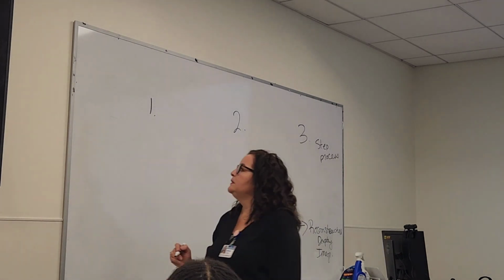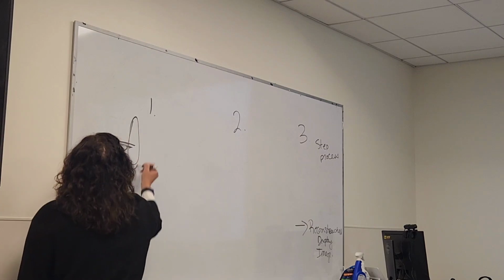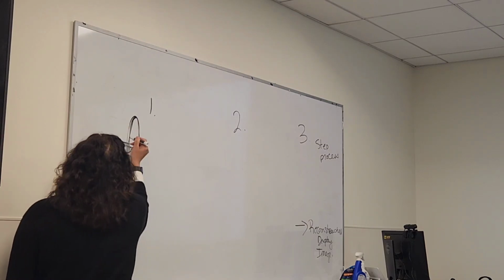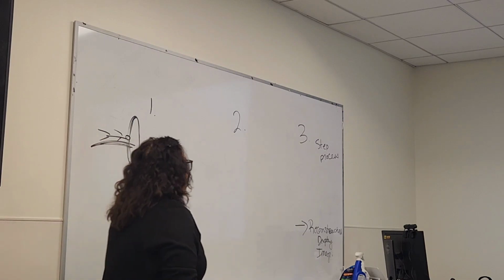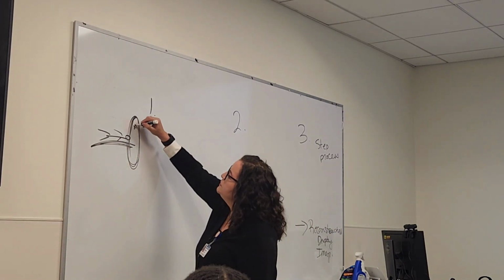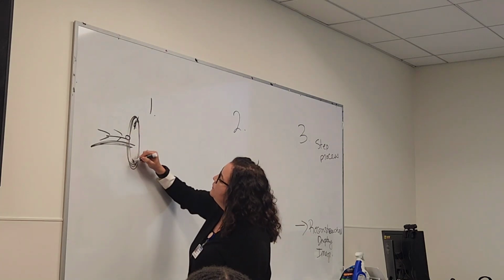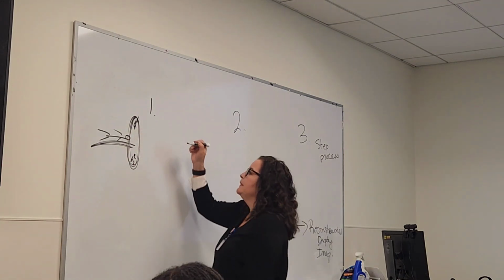Now I just told you that this person is going to lay down on a table. They're going to go into this machine called a gantry, right? Here they are, I'm drawing a sick person. And as they continue to move into this machine, the X-ray is going to align with the imaging plate, and it's going to capture what?